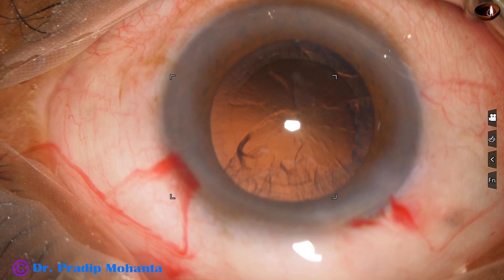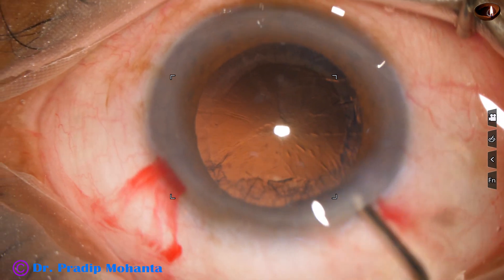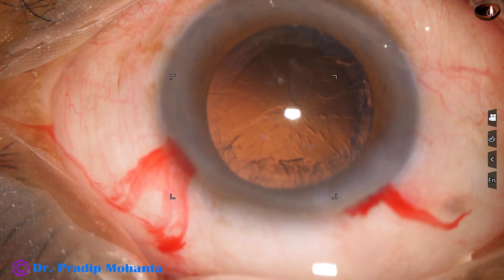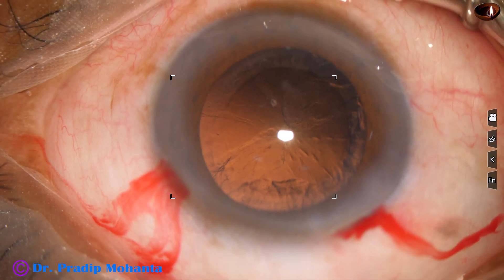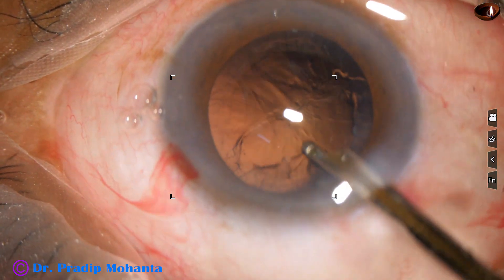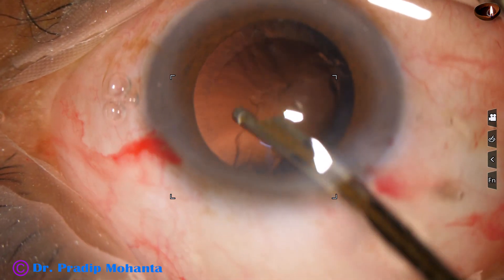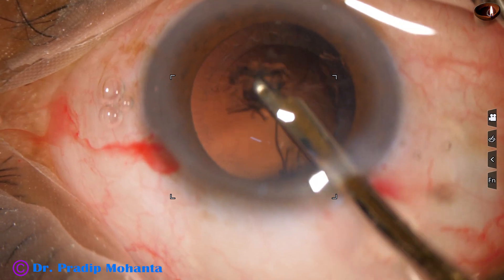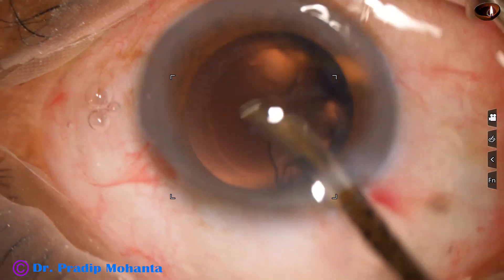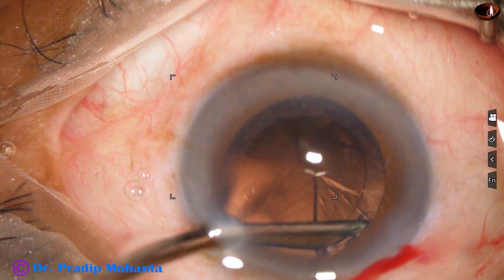I inject viscoelastic. My plan is to remove the rest of the cortex with the help of a Simcoe cannula. The Simcoe cannula is not a patented instrument of the SICS surgeons — we FACO surgeons can also use this very safe instrument. Only one side port is required; there is no side port on the right side. The side port, though a little larger at about 1.6 to 1.8 millimeter, is placed 90 degrees away from the main incision, and the astigmatism induced by the main incision will be neutralized by this side port to some extent.